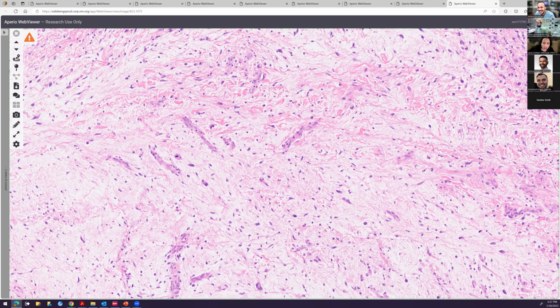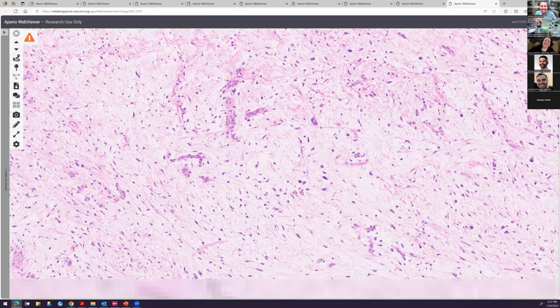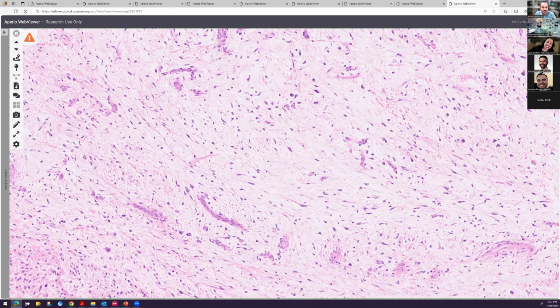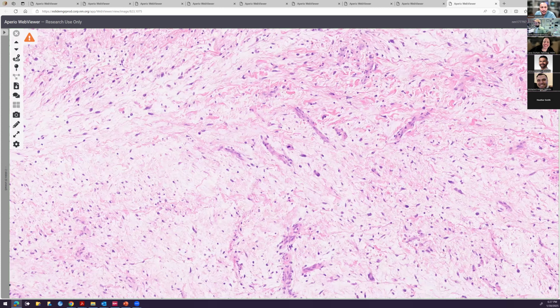Curvilinear vessels. Yeah, now we want to get into these curvilinear vessels. What the hell's a curvilinear vessel? Is it curved or is it linear? Honestly, they all look linear. I don't know why we call them curvilinear. Where's the curving? There's a little curve right there, right? The little angle. It's just a bit of annoying nomenclature, but yeah, they have these long, kind of curving vessels. Right? What about cytology?